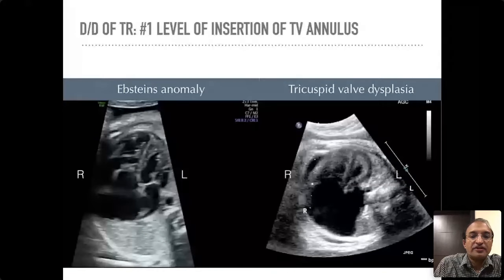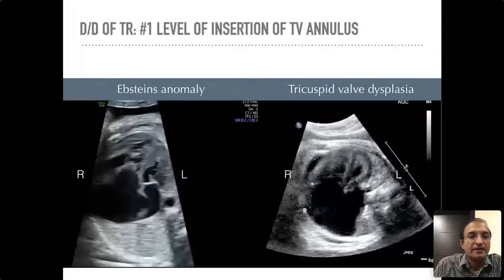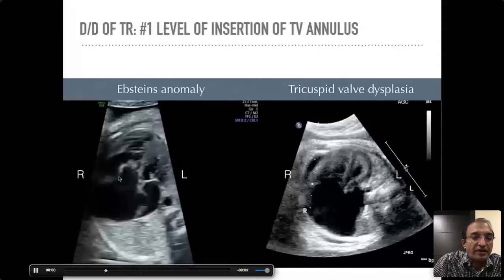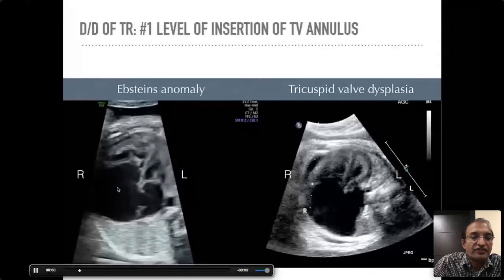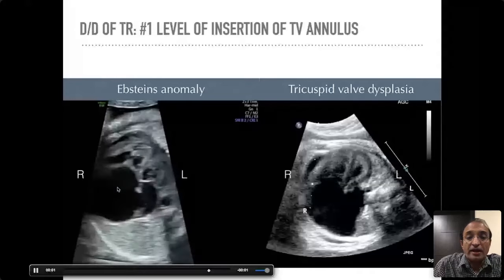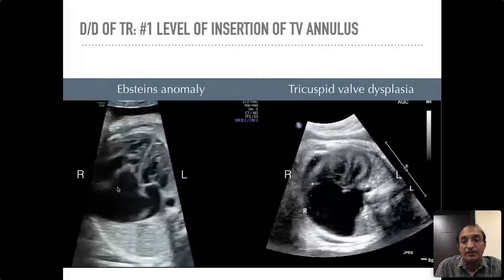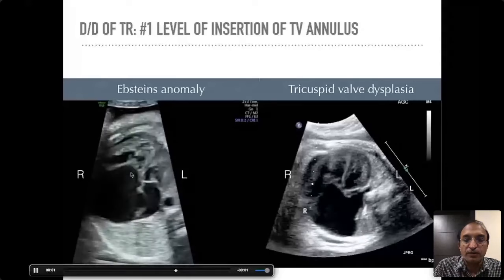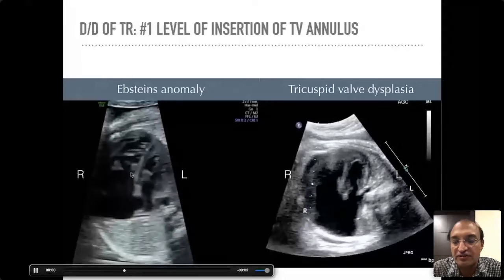Let us look at these pictures side by side. This is a movie I have labeled as Ebstein's anomaly — you look at where the tricuspid valve is inserting. Right and left are marked for reference, so you know which is the right ventricle and valve and which is the left ventricle and valve. This is the tricuspid valve dysplasia. In Ebstein's, the tricuspid valve is inserting at a much lower level — it is displaced downwards — while in tricuspid valve dysplasia it stays at its normal insertion level.